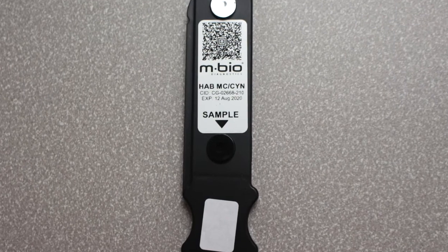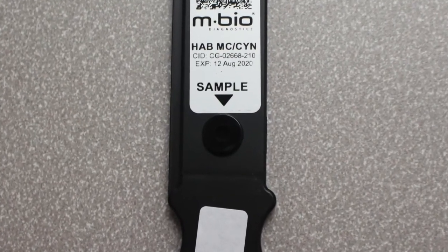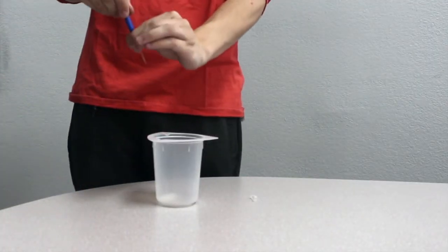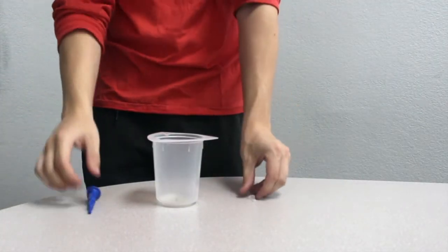Once combined, draw up the mixture and dispense into the cartridge in the space marked Sample. Now the cartridge is ready to be run. Dispose of your pipette tip and reagent tube before proceeding.